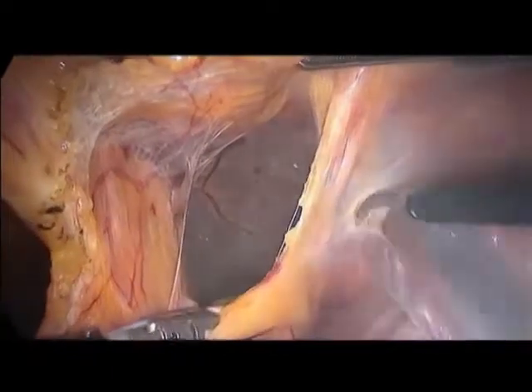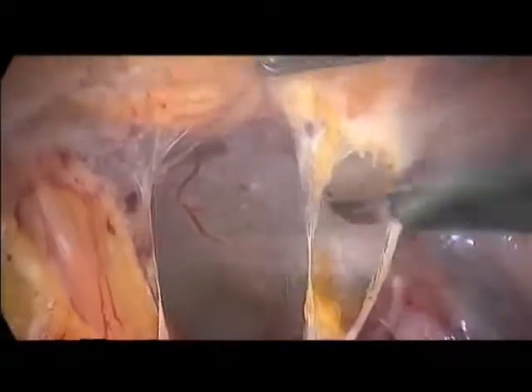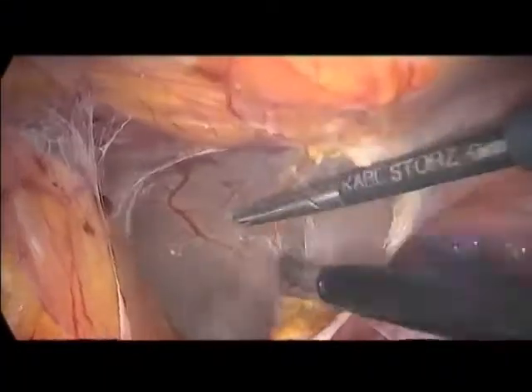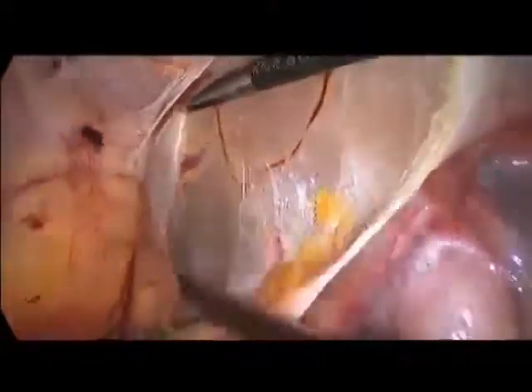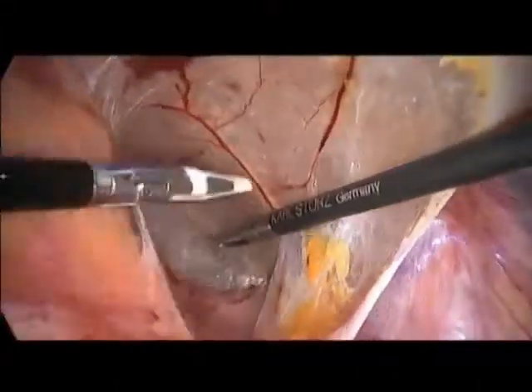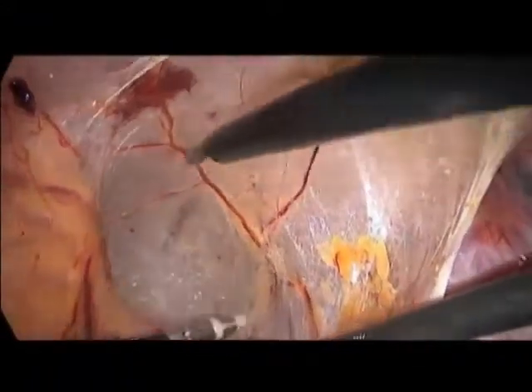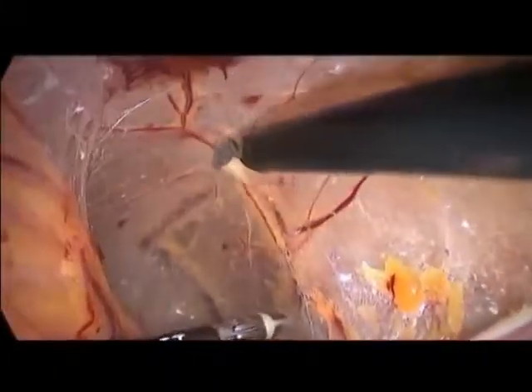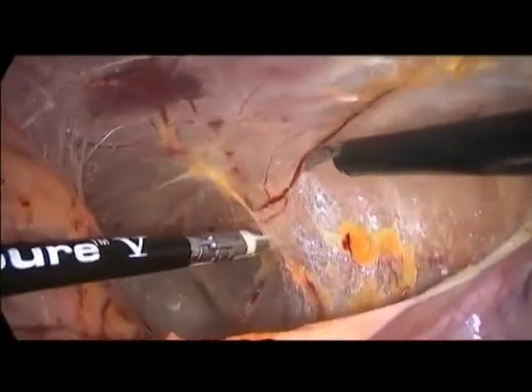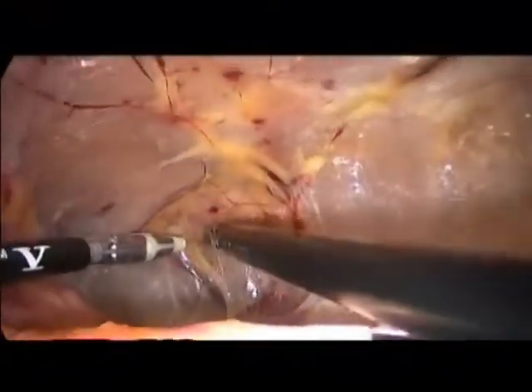What we have to pay attention to, of course, in this lateral incision is the epigastric pedicle that we will see maybe a little later. But actually, we can just nicely and gently develop this plane. You see that the bladder is falling down immediately, surrounded by its fat. Yes, no contact. Okay, better so. And you see immediately the pelvic brim with the pubic bone here. But we will go deep later on.